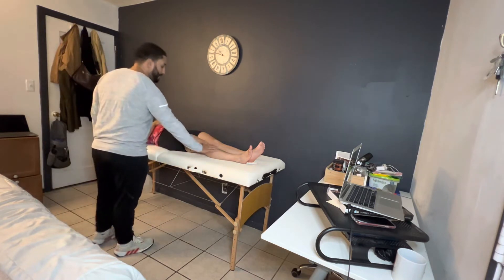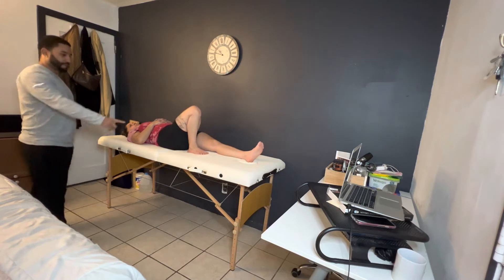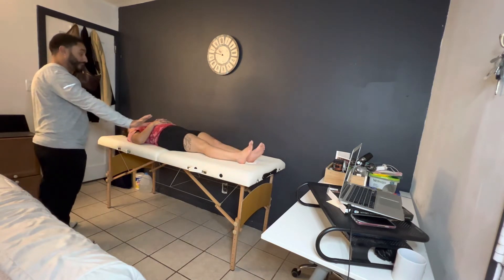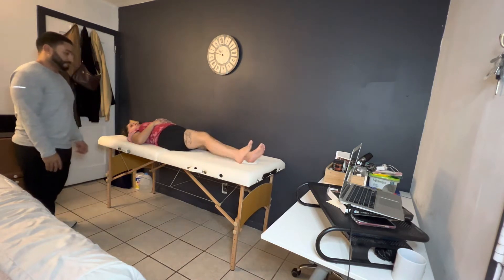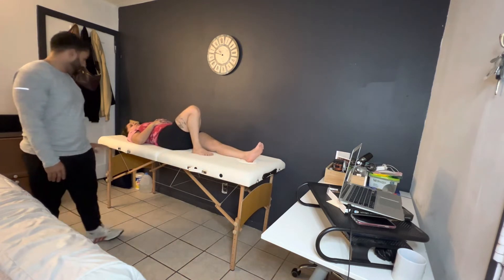What I want you to do right now on your own is bend your right knee as far as you possibly can, and do it again for me two more times. Let's make sure our foot is flat on the bed every single time, and one more time for me. Any issues there at all? All right, perfect.